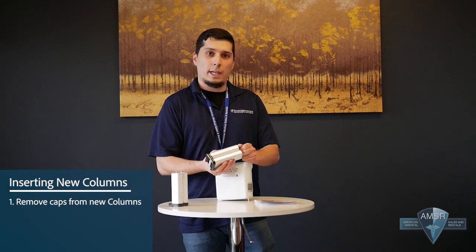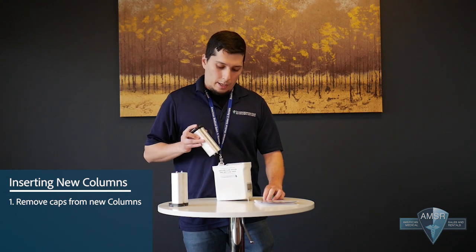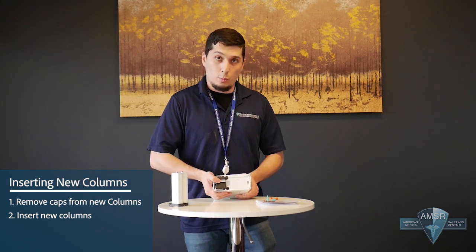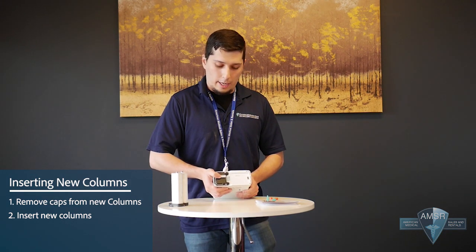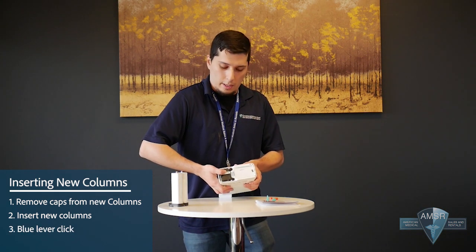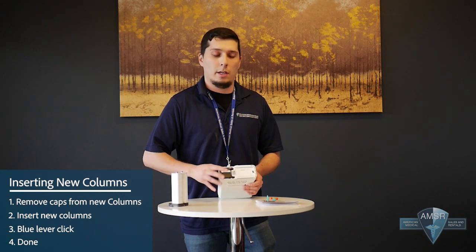So you remove the caps from the new columns and you insert as shown. There's only one way to put it in. You can't put it in backwards. Once you hear the blue lever click, the items are fully inserted.